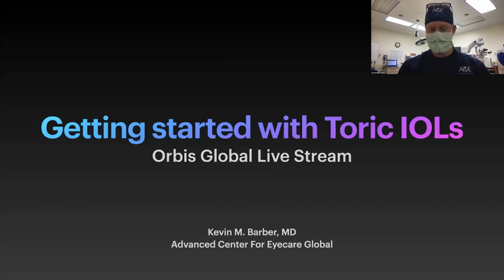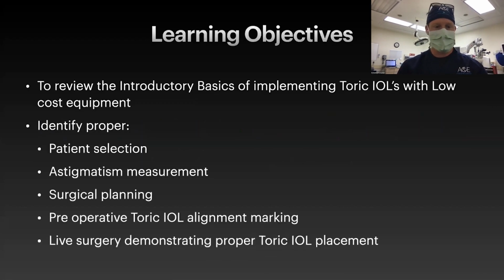Now, this is not a deep dive into toric lenses. There is so much information with astigmatism management. Our goal is not to cover all of that today. Our goal in the next 10 minutes is to basically give you the fundamentals. If you've never done a toric lens before, or if you're early on in your toric lens experience, I want to give you some pearls on how to do this successfully.